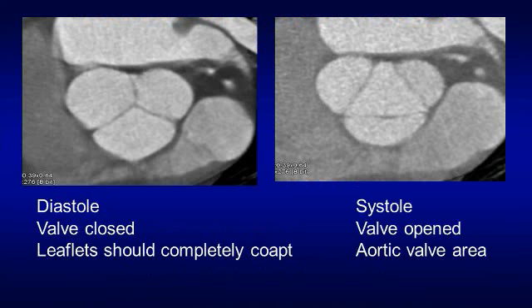Here's a nice example of a normal valve. On the left during diastole, the valve is closed and the leaflets have completely coapted. On the right during systole, the valve is open and we can measure the aortic valve area. As the valve becomes diseased, the leaflets will not close completely during diastole, resulting in aortic regurgitation, and they won't open properly during systole, resulting in aortic stenosis.